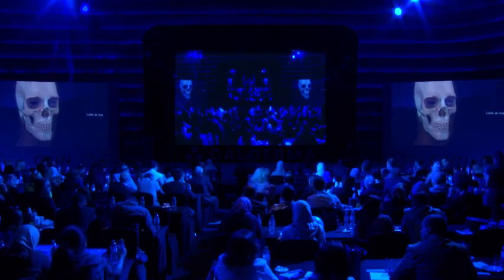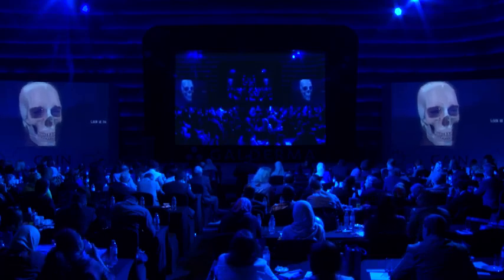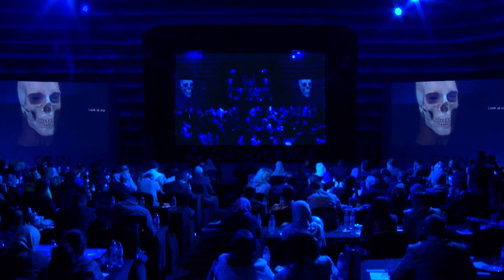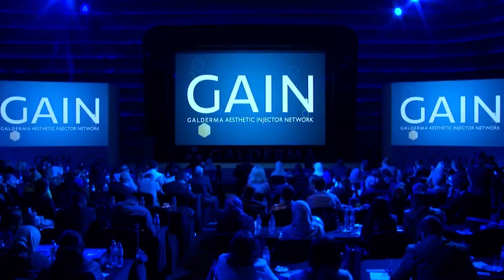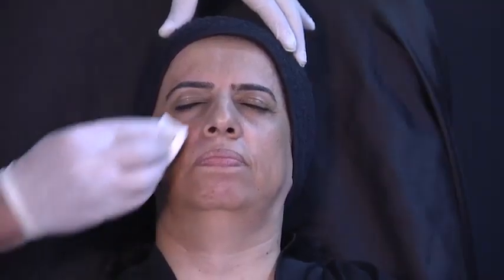Right, so I have injected 1 ml, okay? Now, remember that the tower technique and the zygomatic arch is normally done with Lift, and it's normally for patients that need a lot of lifting and have thicker skin and more volume, a round face. So more than 1 ml in that area, I don't think it's needed, or you will over-treat, over-project.